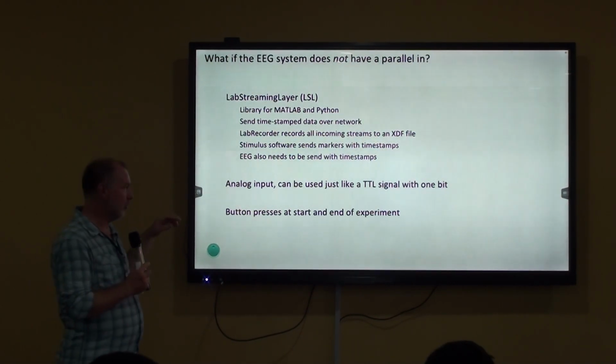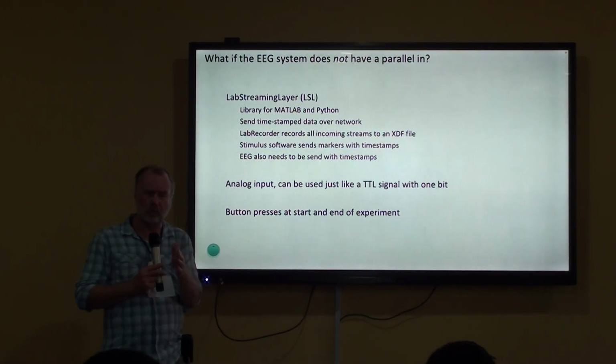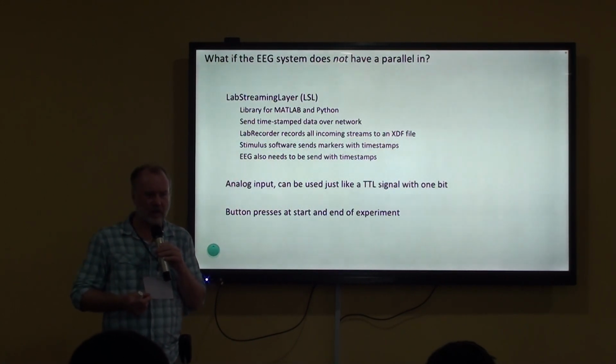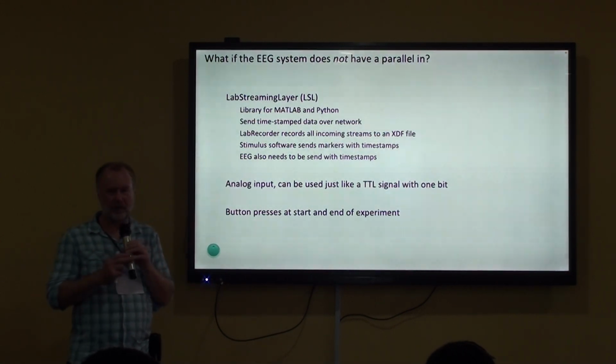If that still doesn't work, a lot of amplifiers have the ability to record in the software when something happens. Especially in clinical amplifiers or clinical recording systems, you can make an annotation. So with such an annotation, you can specify when the stimulus happens.